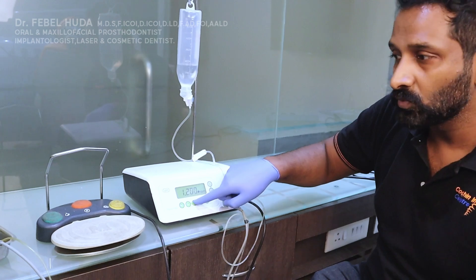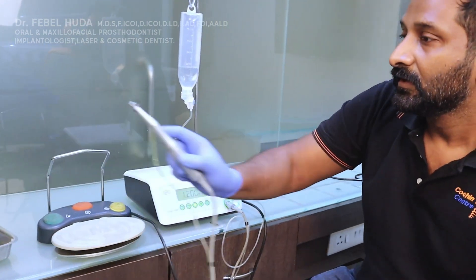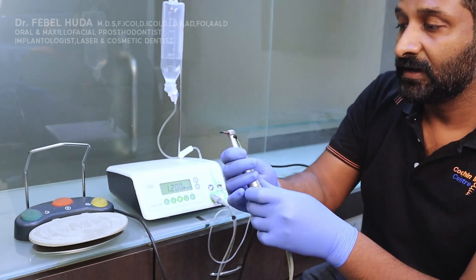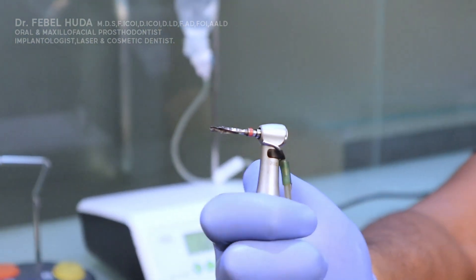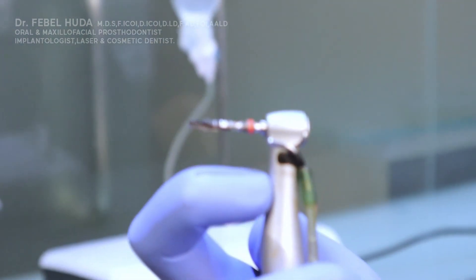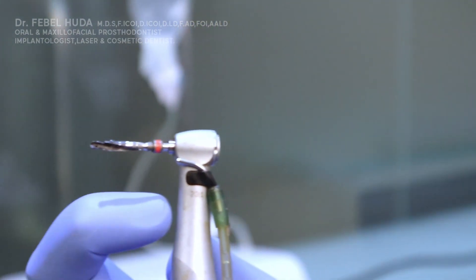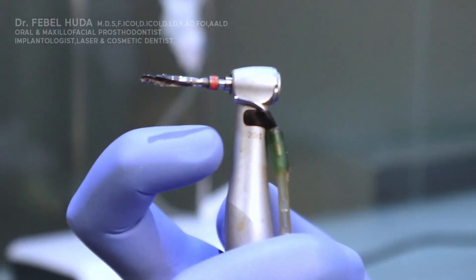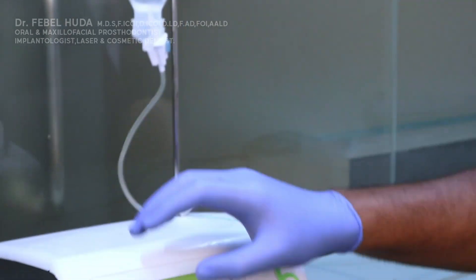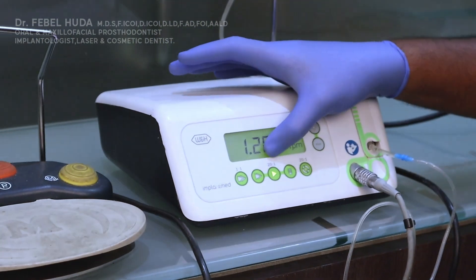For implants, you need to be in the 20:1 ratio mode. You must make sure your handpiece is also a 20:1 handpiece — you can see '20:1' written on the handpiece itself — and you set the same 20:1 mode on the unit.